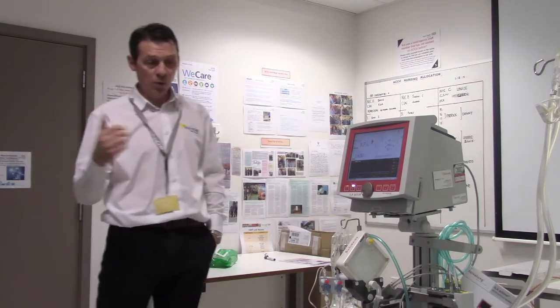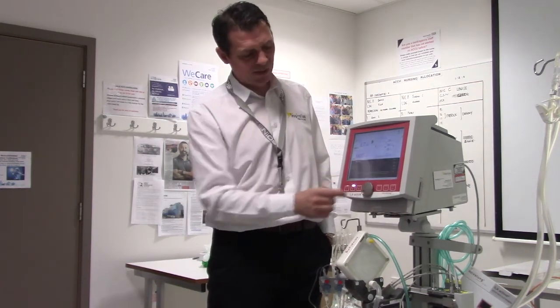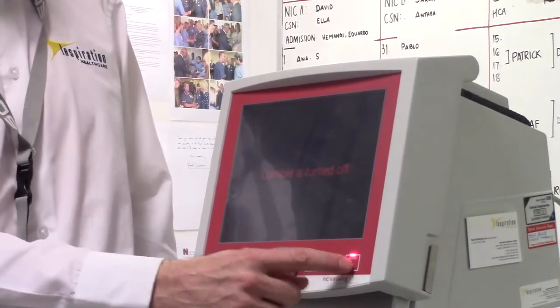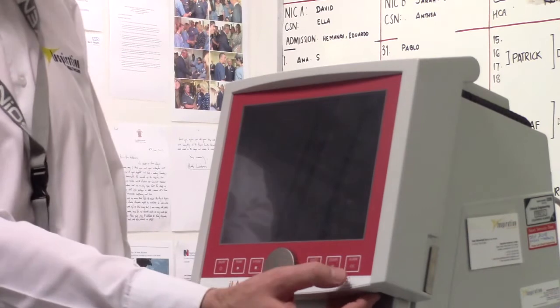The key take-home message is to make sure you get patients spontaneously breathing and get that pump going — that could be tricky. To switch off the machine, make sure the pump is off first. Press and hold the off button until it starts to shut down, then confirm by pressing the alarm button and releasing.